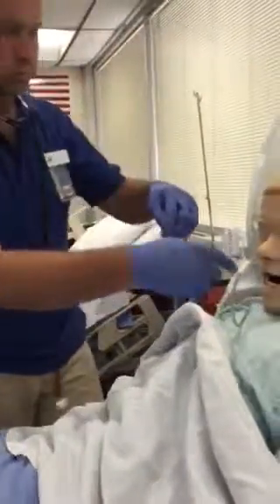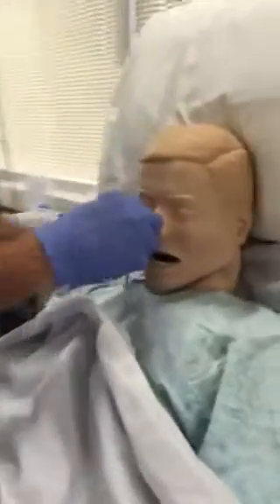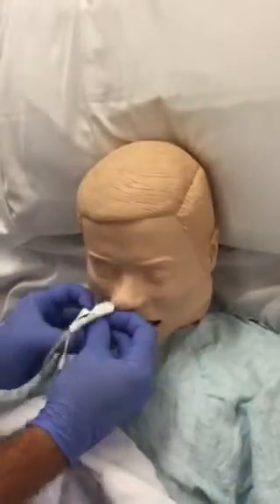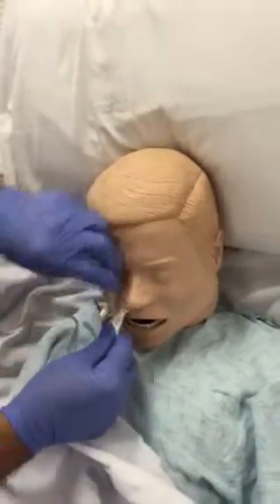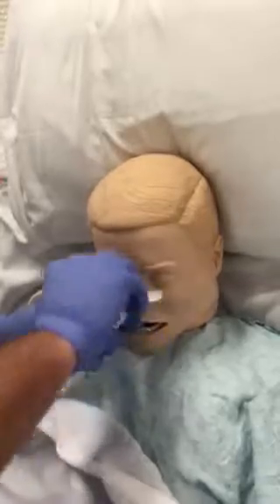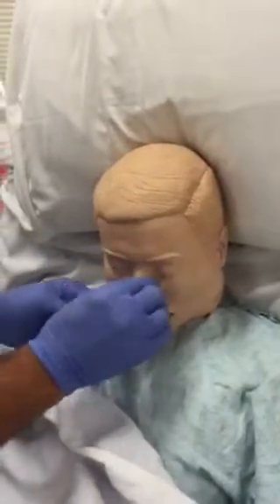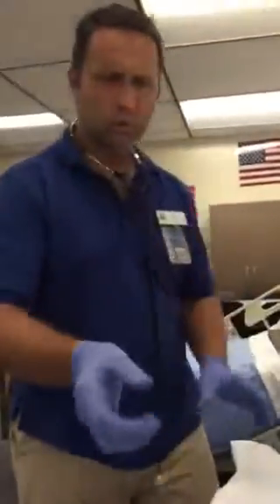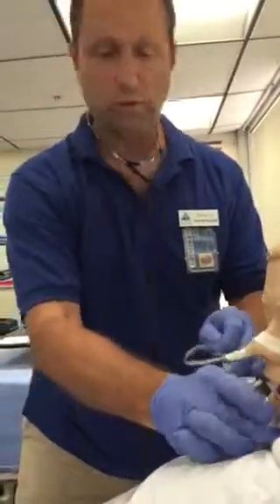I'm going to take our little strip of tape. There we go. We're going to lock him in there. There you go. You look good. Okay, and we did apply the suction. Now, I'm going to check with him that he's doing well, that he's not choking.